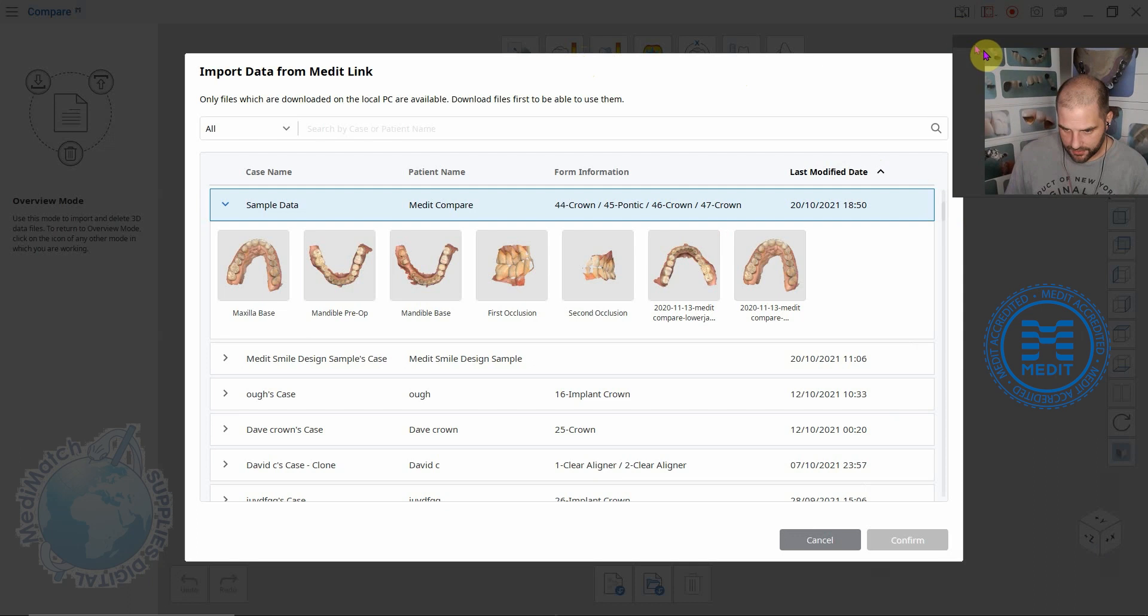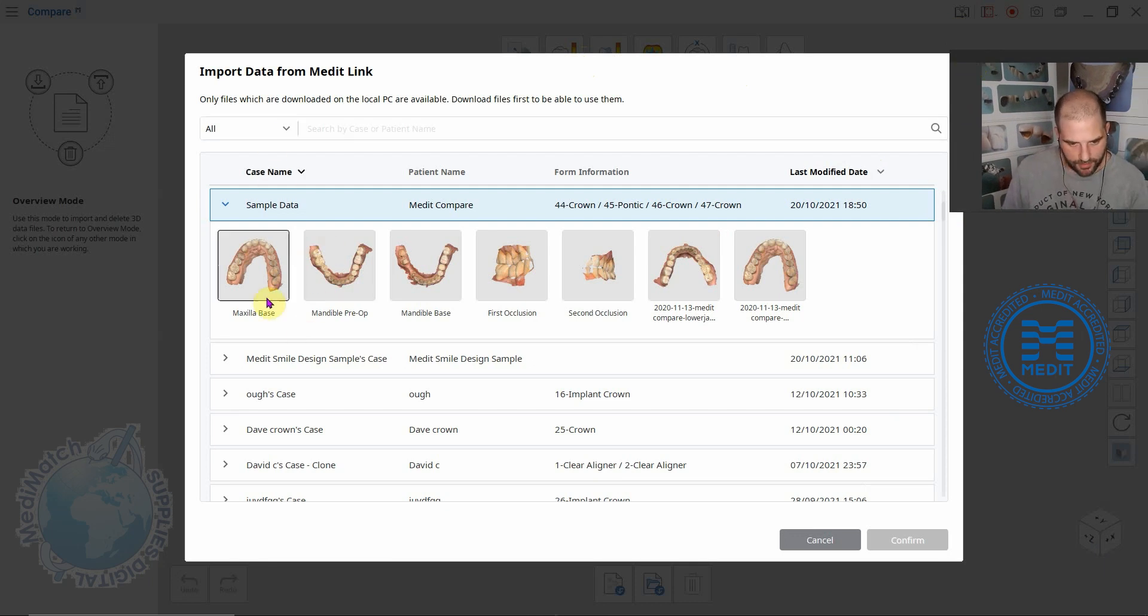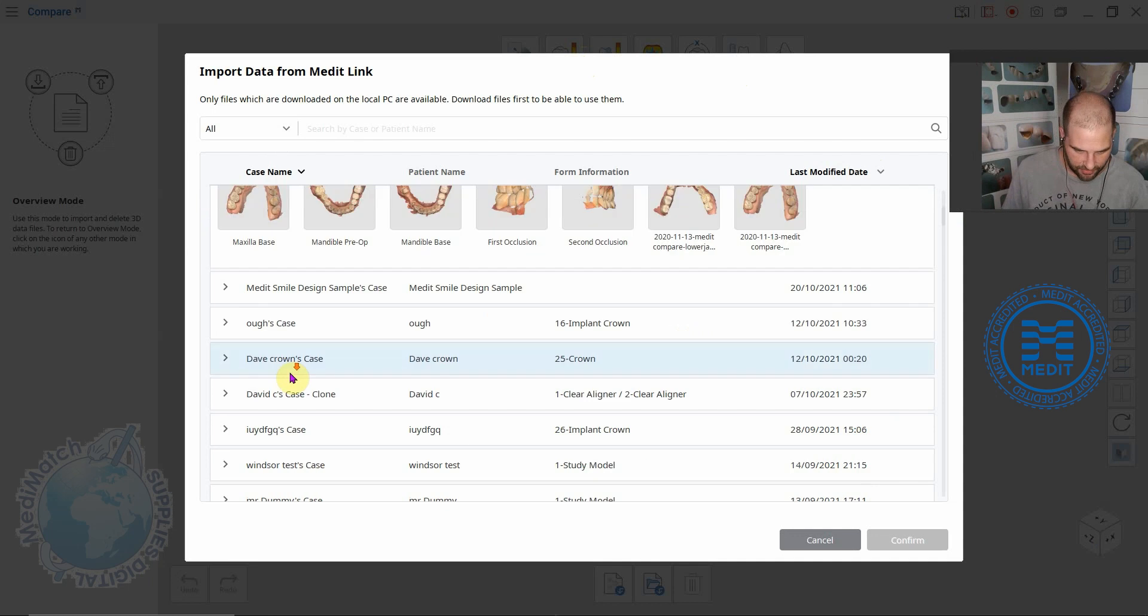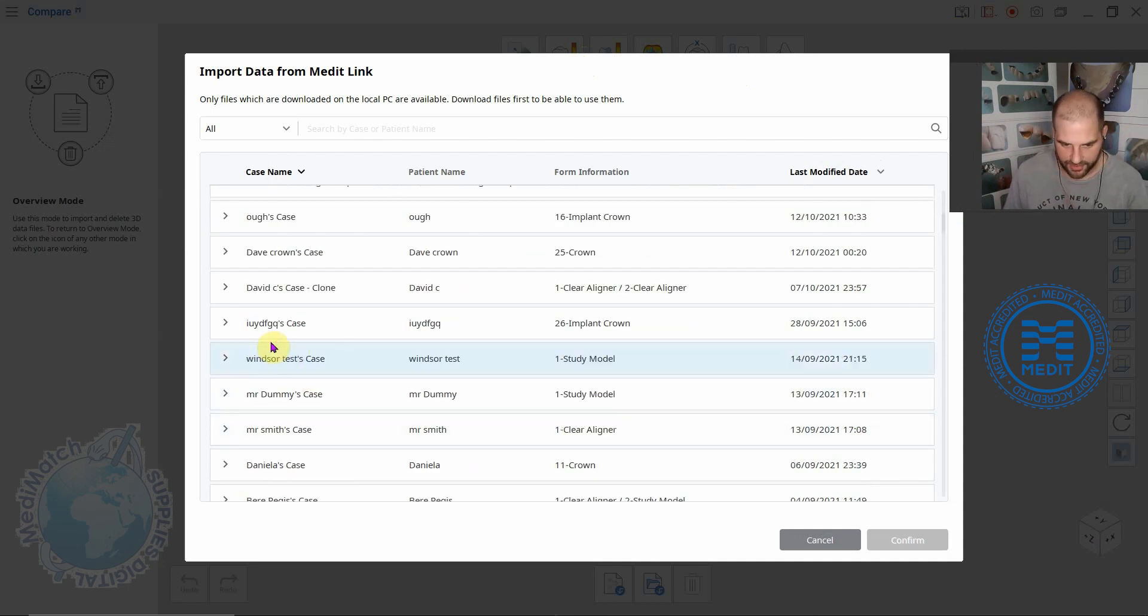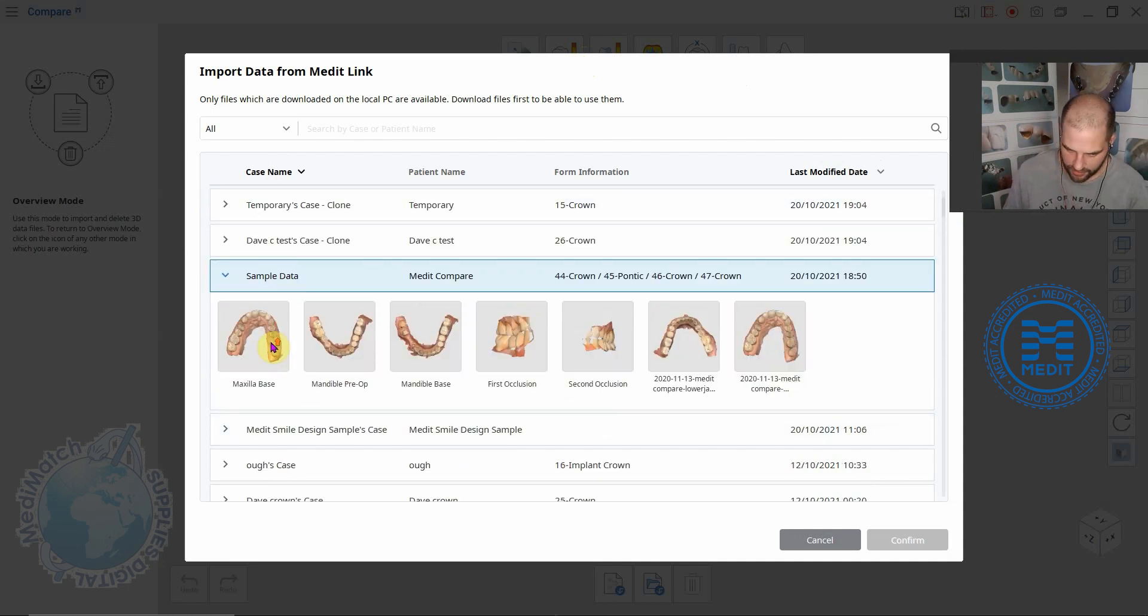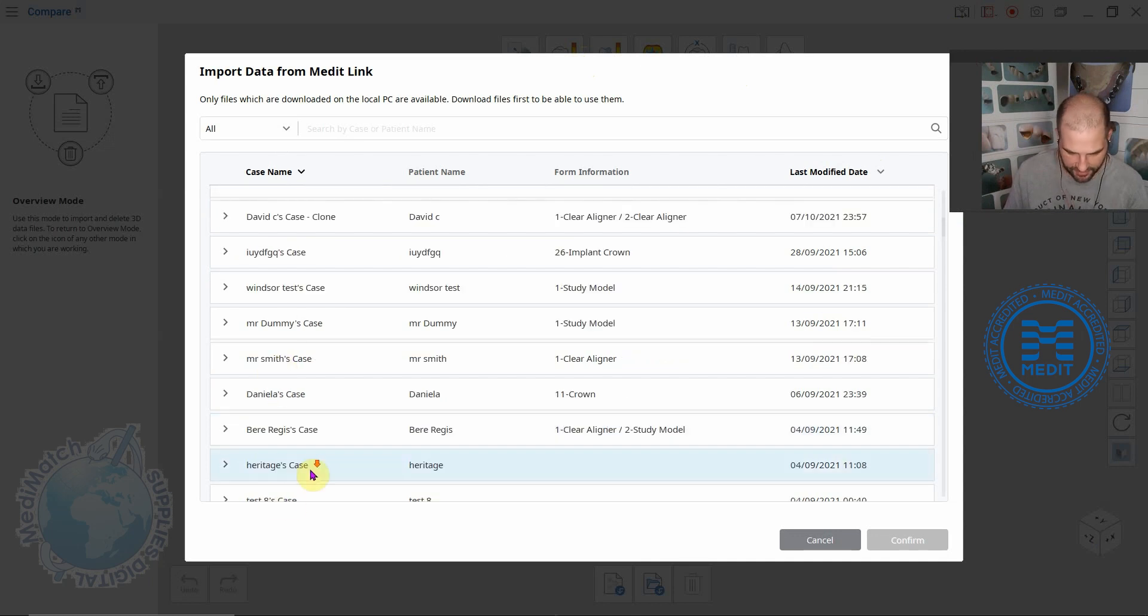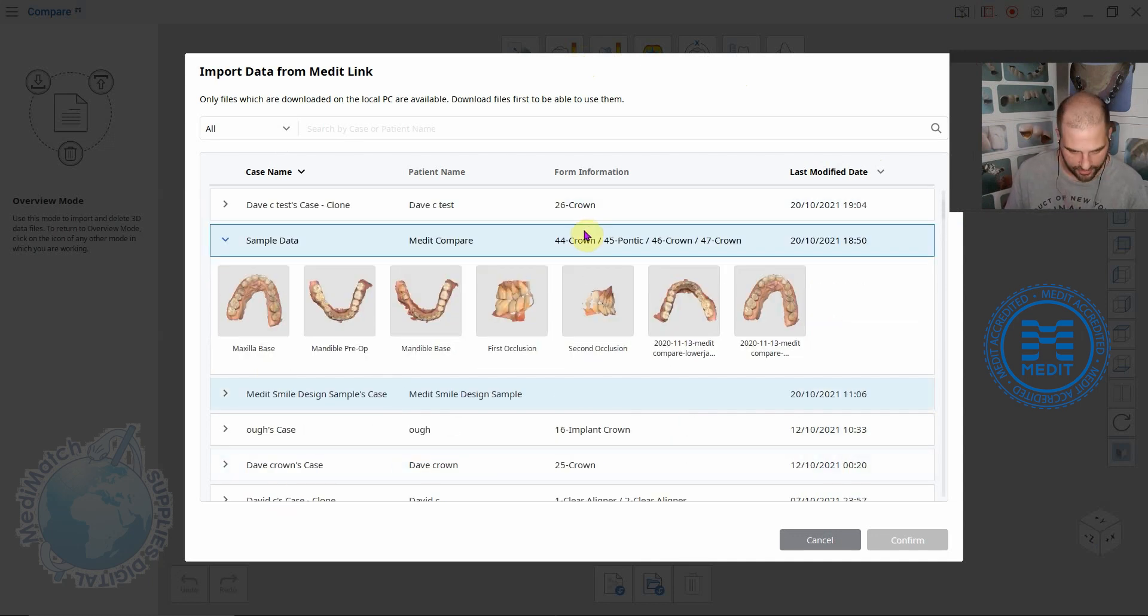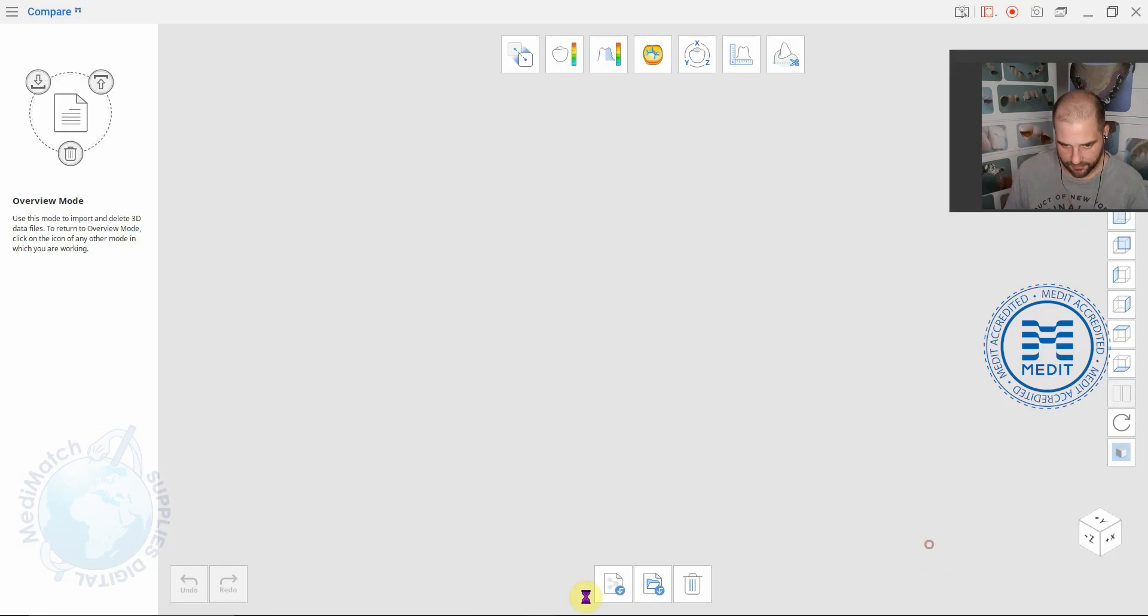It's asking us to select some files that we're interested in using in the Compare app. In this case this sample data has got all of these scans but it also lets you select from other cases that you've done historically in the past. Maybe you've got the same patient under two different instances. You can select one scan from there and another scan from anywhere else. We'll just select all of these for now and click confirm.